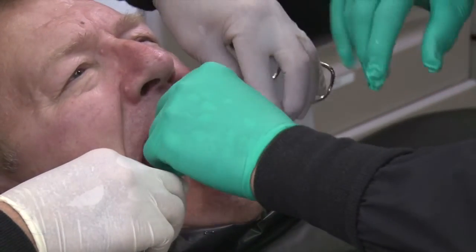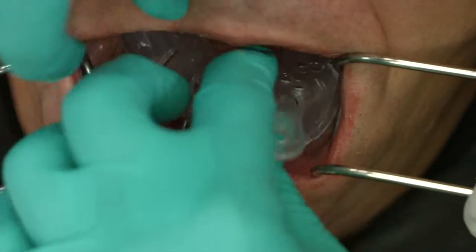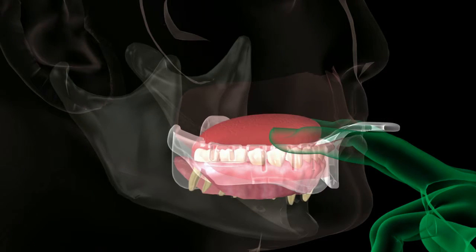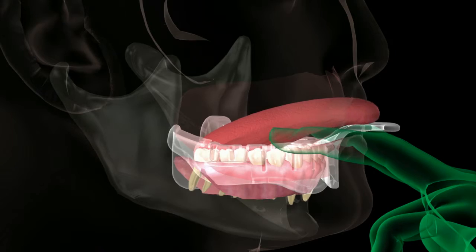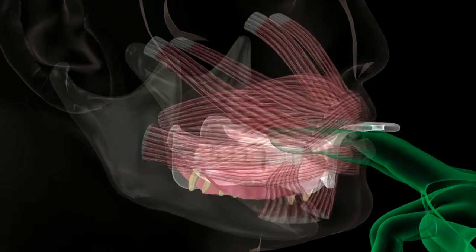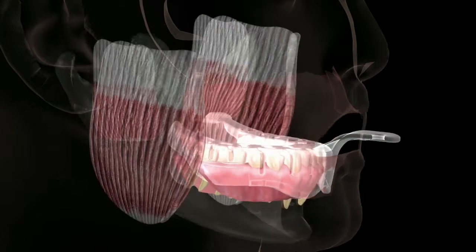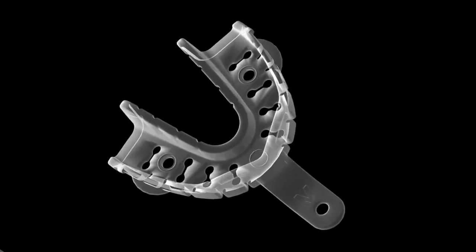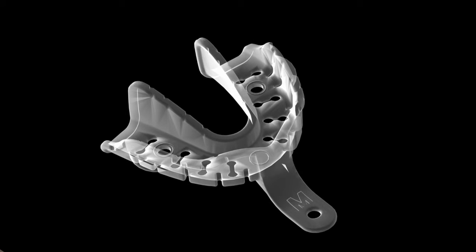For the mandibular arch, the operator will seat the tray over the ridges. The retractors are removed, and the patient is instructed to extend the tongue, suck outward, and smile. Again, these movements should be completed within 10 seconds. The resulting tray will conform to the shape of the mandibular arch, following the ridge configuration, and even adapting to moderate-sized tori.